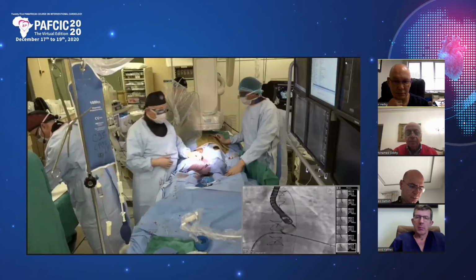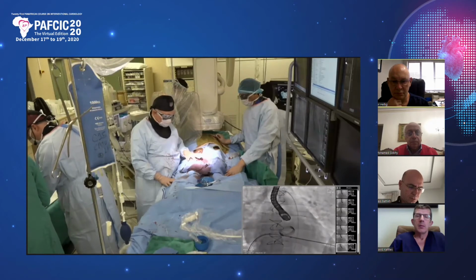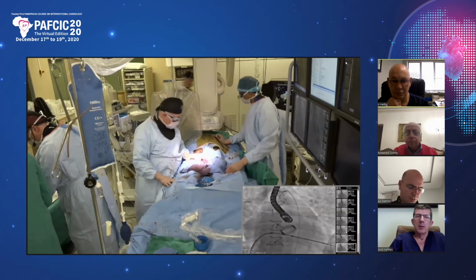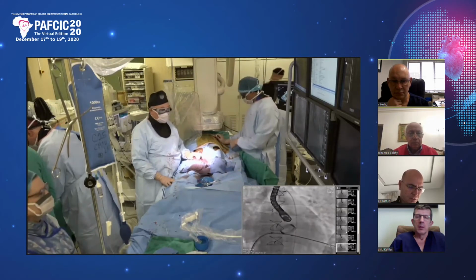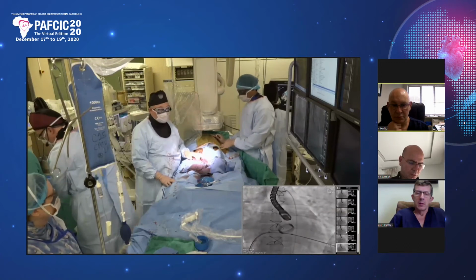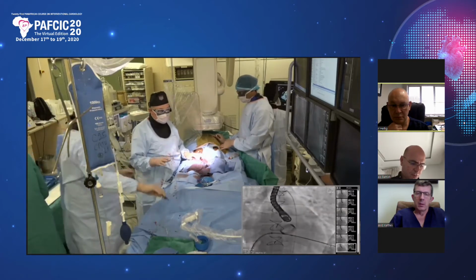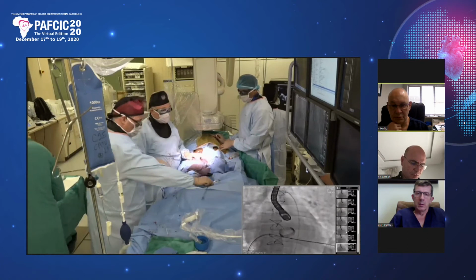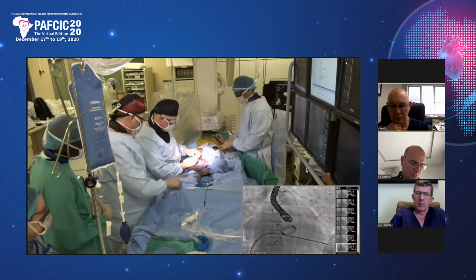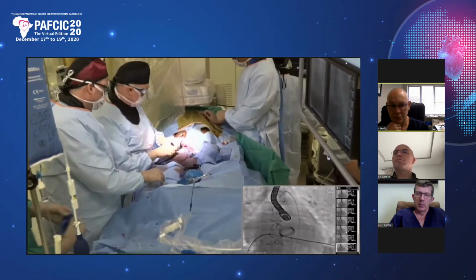I'm going to now take out the transeptal sheath. We're going to leave the safety wire and the other wire across the apical sheath, and we're going to place the delivery sheath parallel to the V18 wire. So the V18 wire is not going to be in the sheath at the femoral venous access site, but the V18 wire will still remain through the apical sheath. So I'm going to now remove the transeptal sheath. I'm going to ask Shaheen to hold the wires. Both.